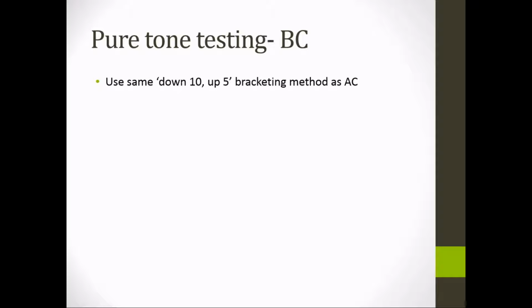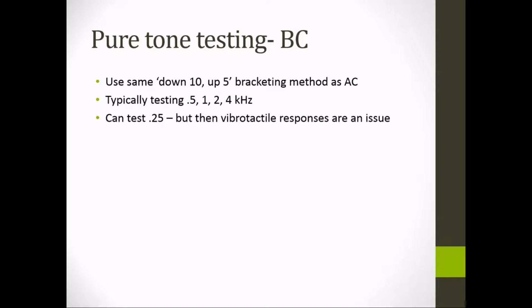For bone conduction testing, we're going to use the same down 10, up 5 bracketing method as we use in air conduction. Vibrotactile responses are the biggest issue with 250, and I'm going to show you a diagram of those in a minute.